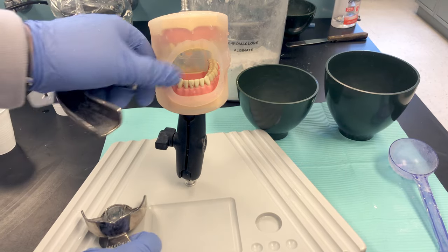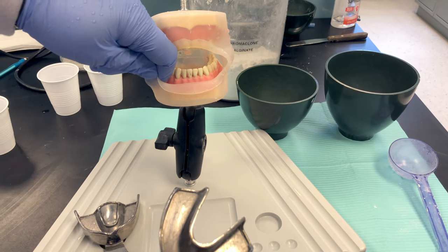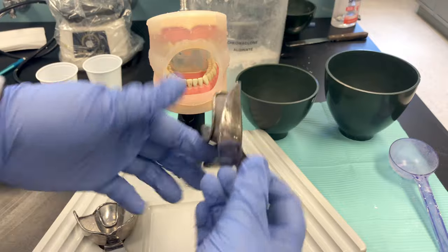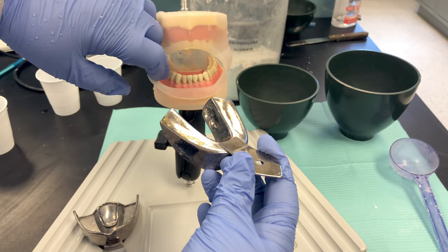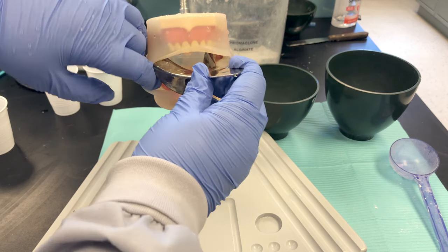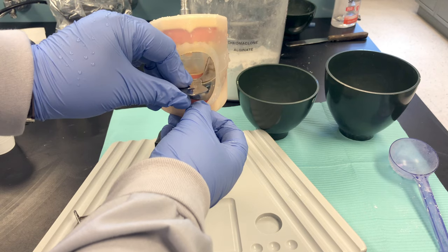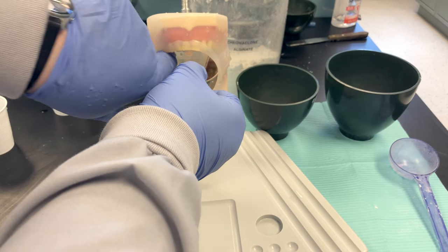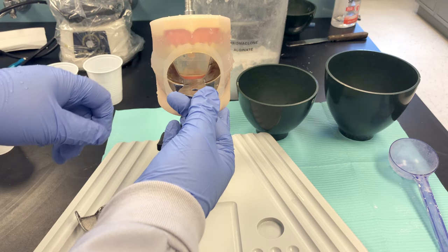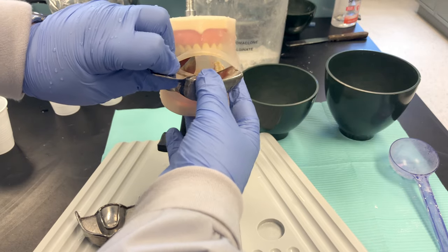Using a mannequin with cheeks makes it more realistic, and they are clear so you can see what's happening. Try in your trays at an angle — I'll do mandibular first, facing down. Retract one cheek, insert at an angle to stretch out the opposite cheek. Seat the posterior first, then swing the anterior down, making sure the tray covers the retromolar area. Have the patient lift their tongue up and out so it doesn't get trapped. If you have a good fit, remove the tray at an angle.